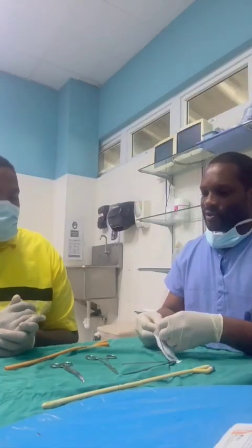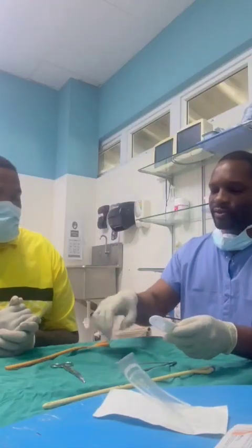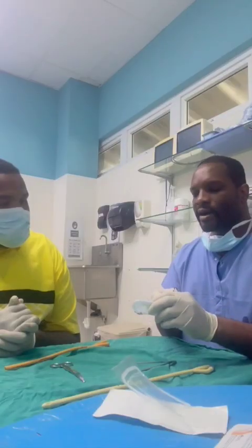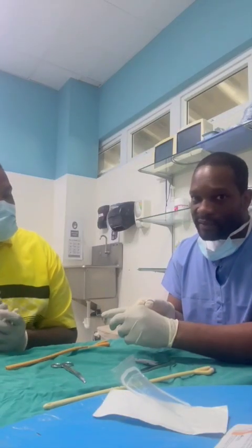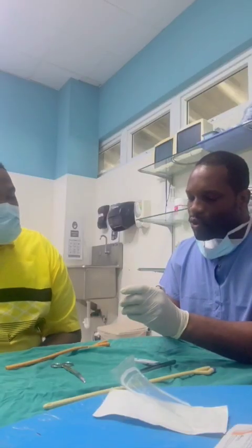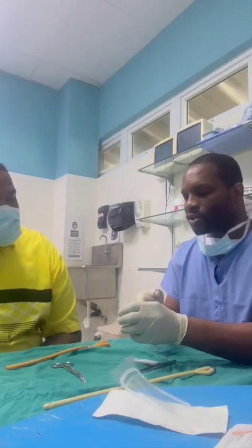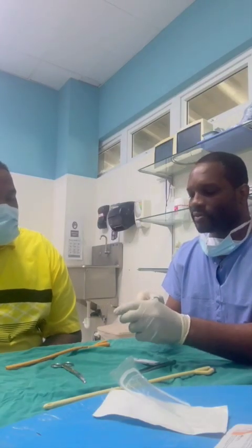So how we load the needle: we load at the tip of the needle holder, and it can be loaded in a half-half configuration where the needle holder is midway along the needle, or it can be 1/3, 2/3, where closer towards the suture it is 1/3, and toward the tip is 2/3 in front of the needle.